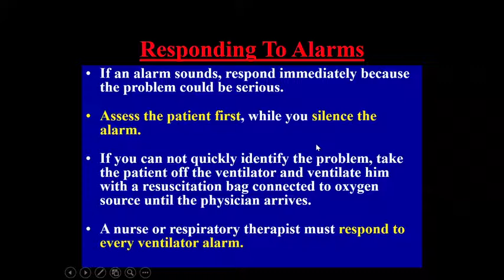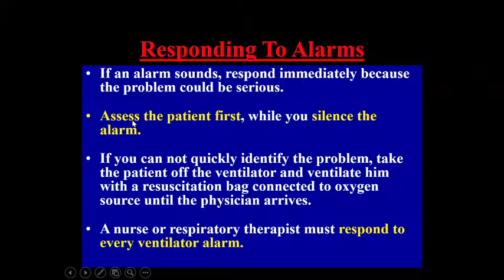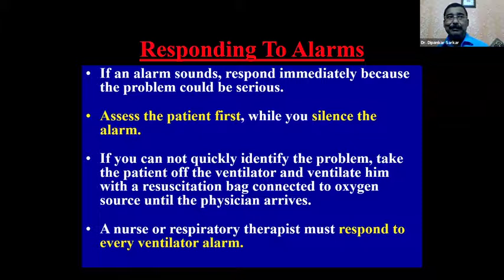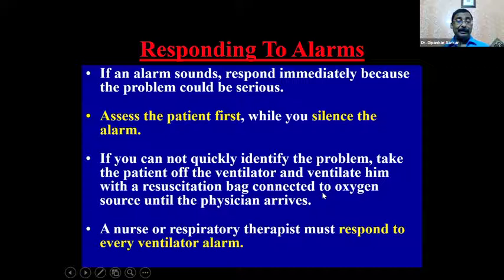Now, responding to alarms. I think for the healthcare professional, the biggest thing with a ventilated patient is responding to the alarm. You will find it is blinking red. That means some alarm is going on. If there is an alarm sound, check what the alarm is. If there is low oxygen, if the tidal volume is not adequately delivered, whether the minute volume is not achieved or the patient is giving too much minute volume, whether the peak pressure is going too high. Whatever the cause, go for troubleshooting and go for the checklist like an experienced pilot. Go for the checklist and correct it. All the treating members and patient care members, the nursing staff, the respiratory therapists must respond to every ventilator alarm. An alarm must never be ignored or disarmed.